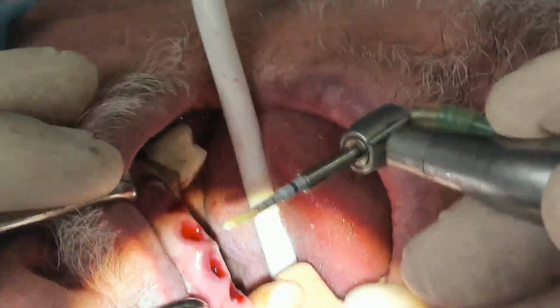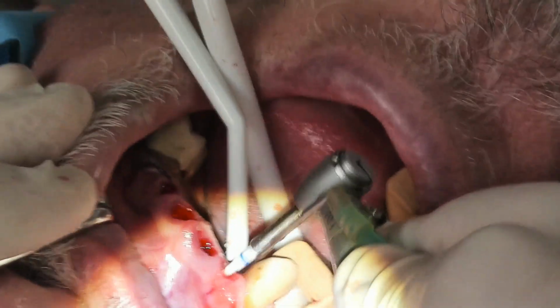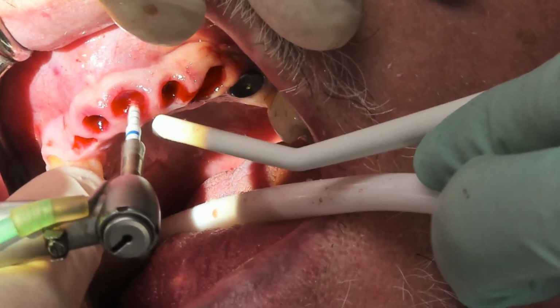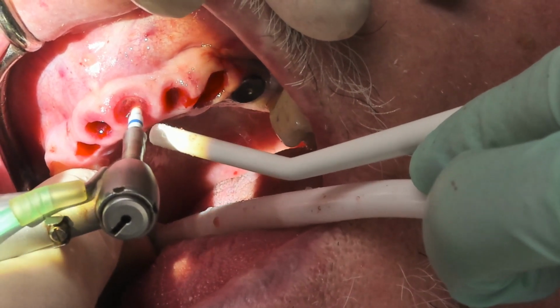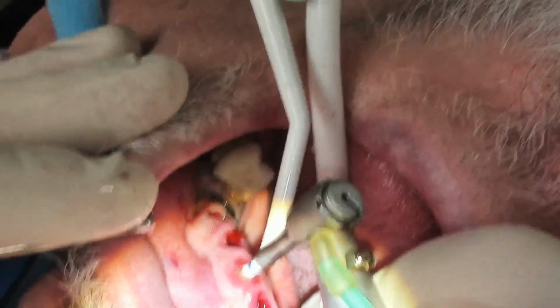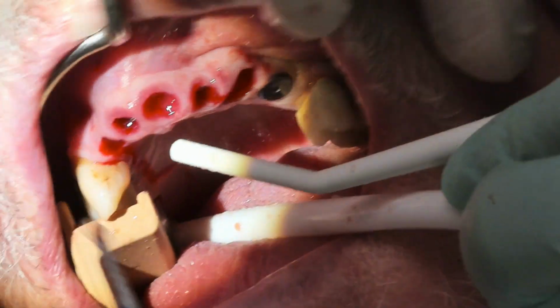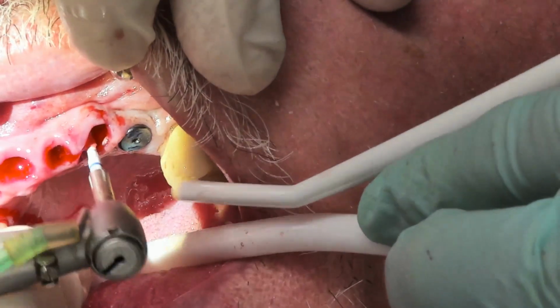I'm just going with the pilot drill. The other thing that's really great about Z-Systems and these ceramic drills is they never go dull, and that's a huge thing. So you can see with the pilot drill, we're prepping the site to 12 millimeters. We're going to do three 4.0 by 12 millimeter implants. So Alan's bone is really, really good, very hard, which is nice, especially in the maxilla.